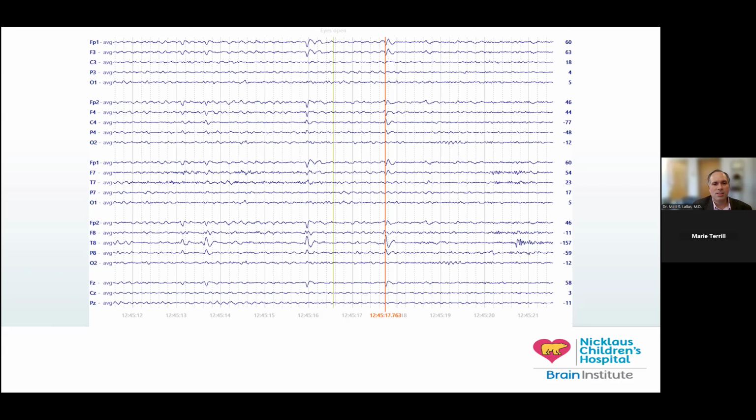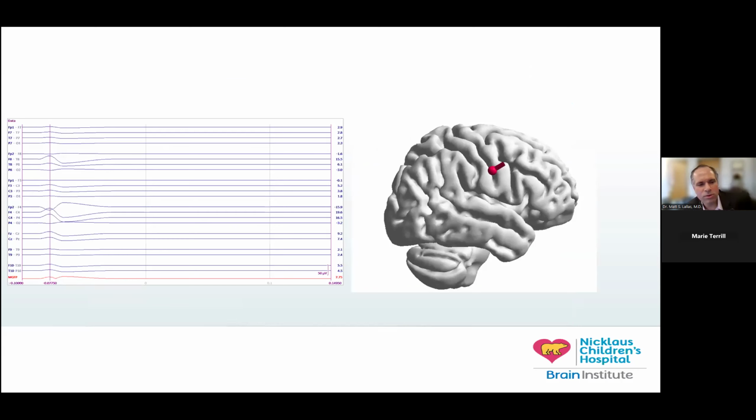And so we have this spike, and we think to ourselves, where is that coming from? But of course, 3D ESI is the approach of putting that directly into a computer and allowing it to show us that relationship in 3 dimensions, so that we can show people what we're talking about. So in general, our workflow when we're looking at EEG is that we have the EEG and we try to picture the source. That's what we call the inverse model. The inverse model is complicated because we have to take into account the skin, the CSF, the brain. The inverse model has no one clear solution. There can be many, potentially infinite, numbers of solutions.